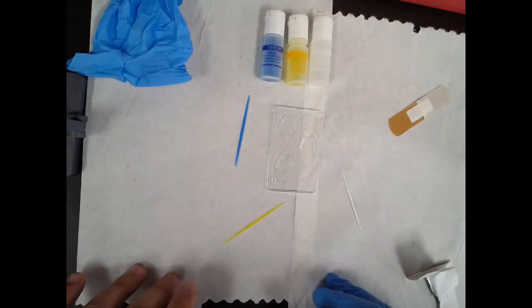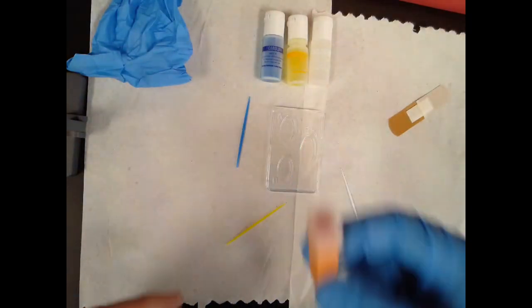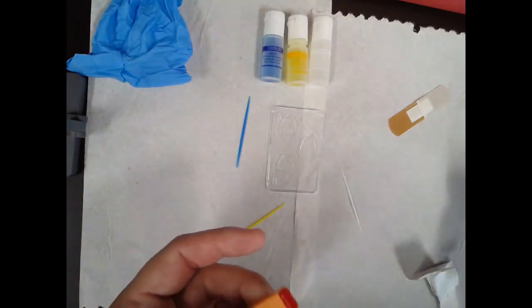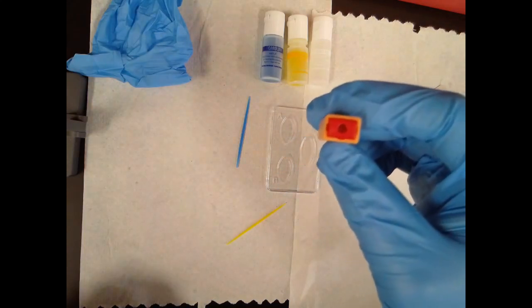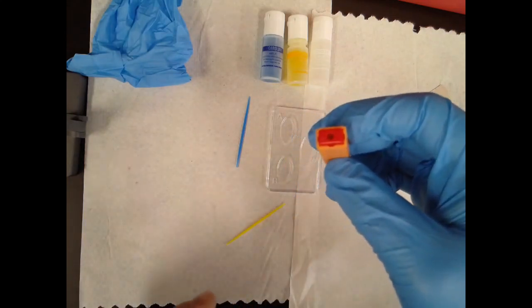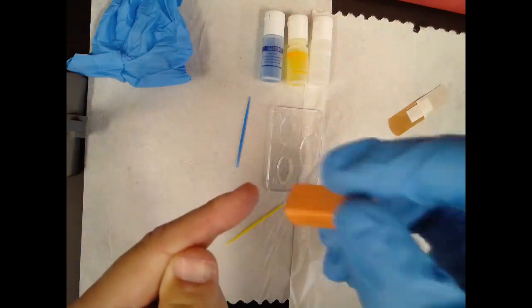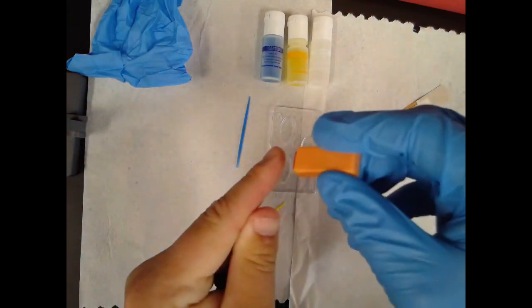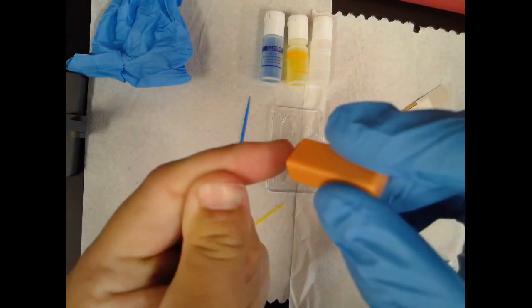The finger is dry. Now, most lancets nowadays are a lot more advanced than when I was a student and doing this stuff. I literally just got a piece of metal with a sharp tip on it and you had to just stab yourself. Now, we got these fancy spring-loaded ones. Basically, what you want to do is remove the cap. Now, these spring-loaded ones are one use only. Make sure that when you use these that you're prepared to use them. As you can see where the hole is, that's the business end of the lancet. There is obviously a needle in there that is spring-loaded. Make sure when you poke a finger, you do it at an angle to where the person can easily get the drops of blood out. I'm going to do it right about here. You see how my fingertip is nice and red? And let's give a poke.